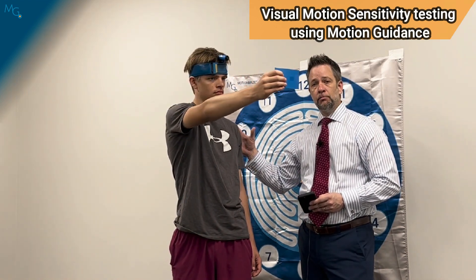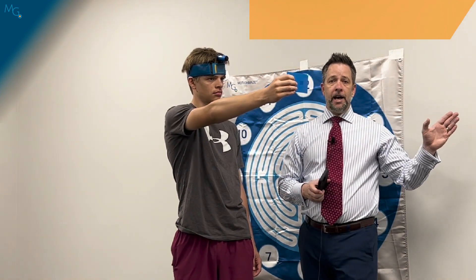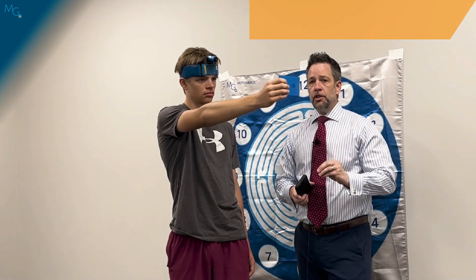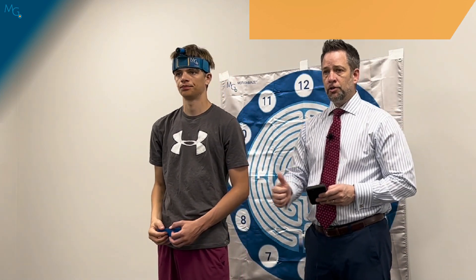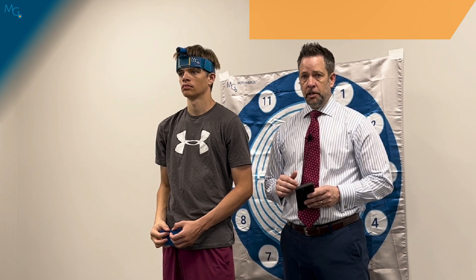He keeps going, and in this time the laser moved sooner, so his head was moving faster than his arm and his torso. In this case, this would actually be changing the intention of the test. We want to have that head, arm, and torso moving at the same speed the whole time throughout the test. And that's where the motion guidance gives us accuracy on this particular test inside of the VMS.